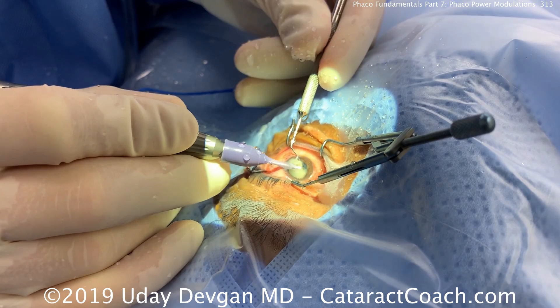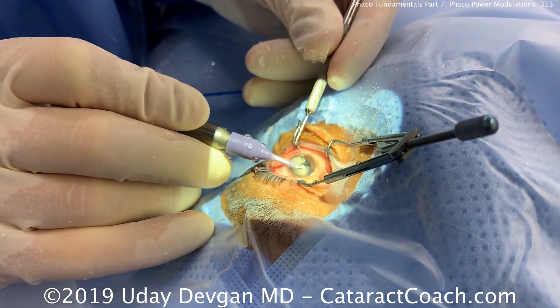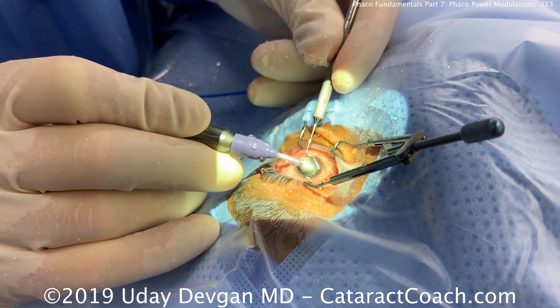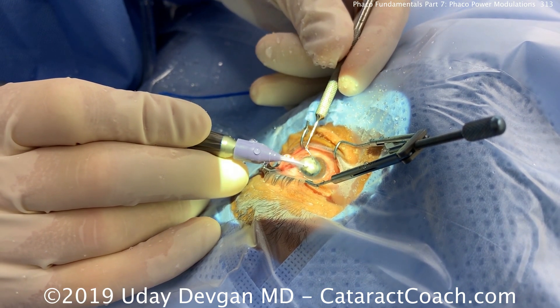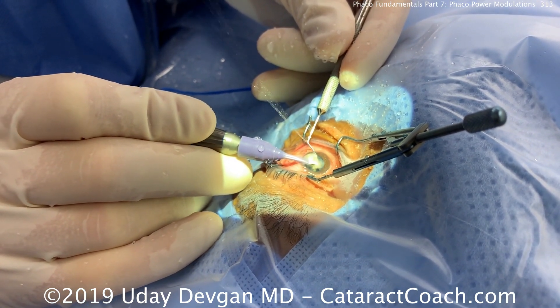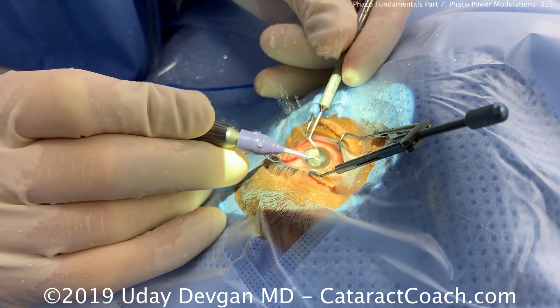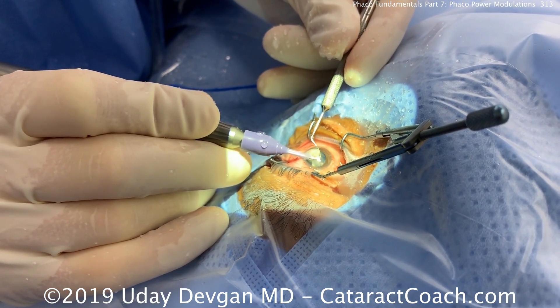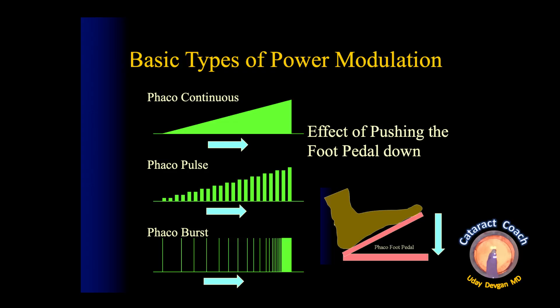To minimize total energy in the eye, we should lower power settings and use phaco power modulations — delivering modulated energy rather than continuous energy. Using the phaco chop technique to mechanically break the nucleus into smaller pieces also helps reduce total ultrasound energy. Notice how leaky the incision remains throughout — that's the ideal situation.